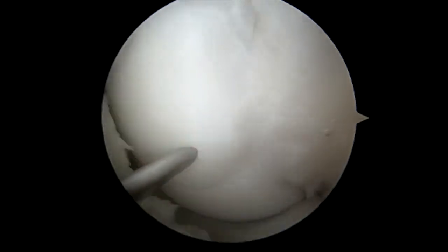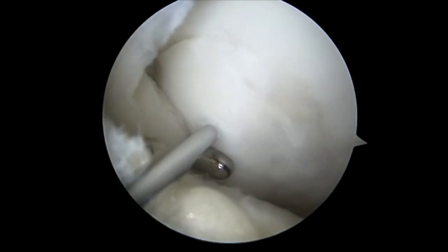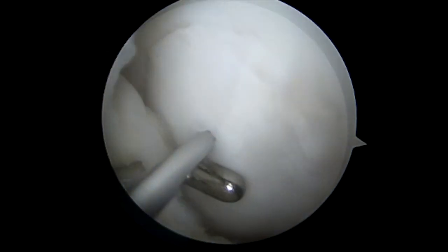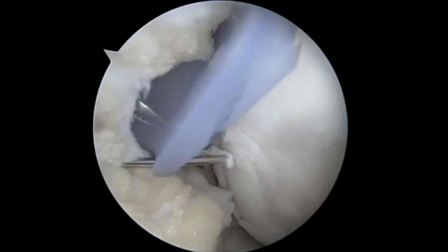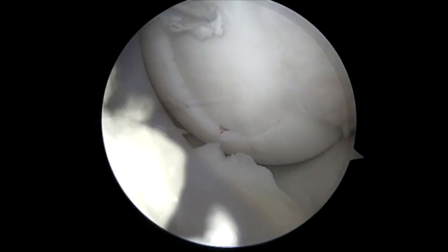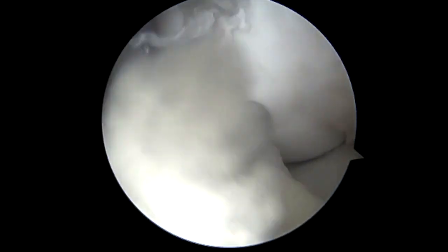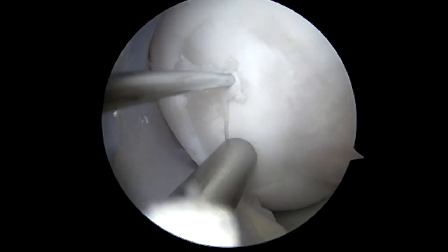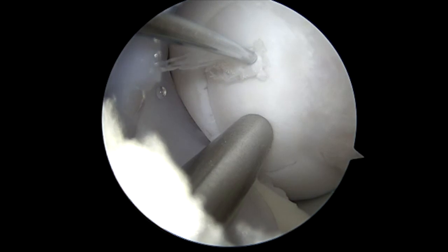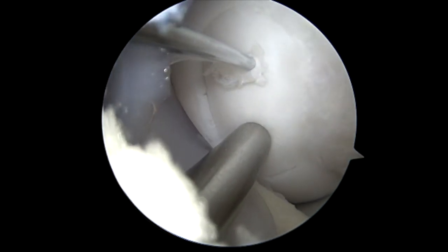You can see here, through a separate transpatellar portal, we place a percutaneous spinal needle. Following this, we use a threaded arthrox cannula system. We use the probe to hold it down, put the passport back in, but remove the medial portion of the passport that allows us to place the wires. We use the cannulated measurement system to dilate the transpatellar portal — this prevents any soft tissue impingement. The first wire is in, and we use this guide system to place the second wire in standard fashion.